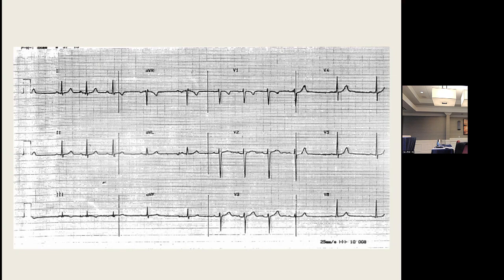And if ever you have a question about a given lead, say, is that the T wave? I'm going to look right below it. And oh, yeah, that is the T wave. You are going to have questions around QRS duration, ST elevation. Always use your leads above and below to corroborate what you think you're seeing.